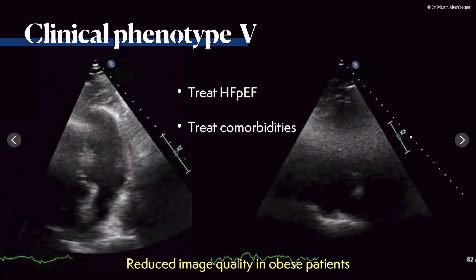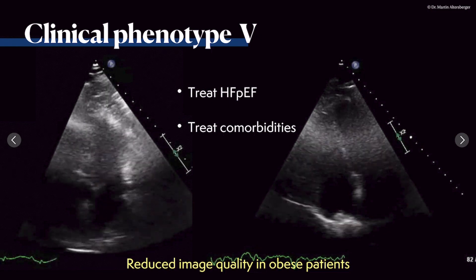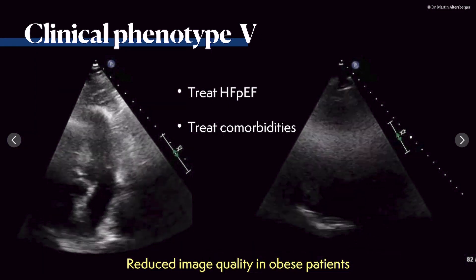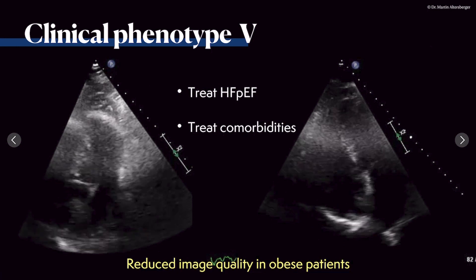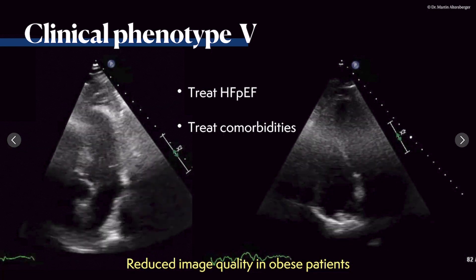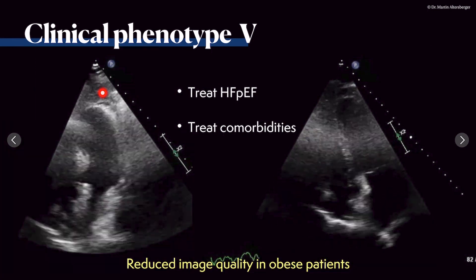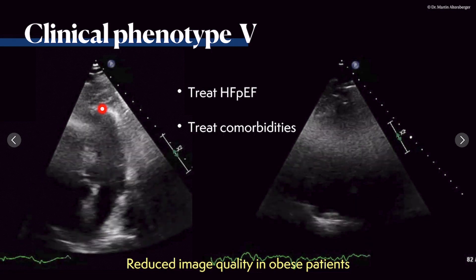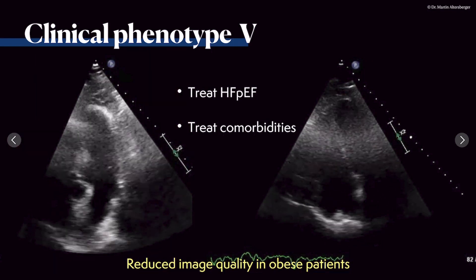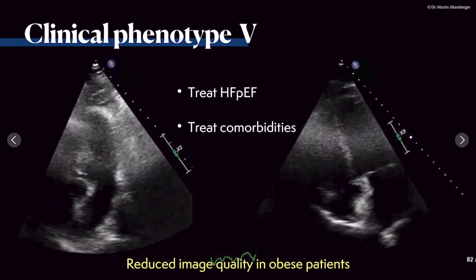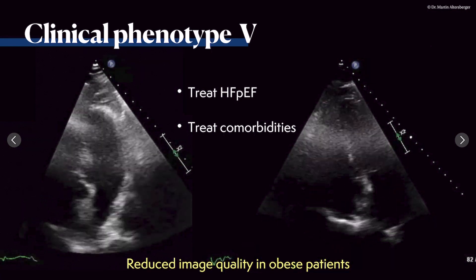What can we do with clinical phenotype 5? Now we can treat heart failure with preserved ejection fraction and also treat the comorbidities. This is an example of an obese patient. We see a lot of fatty tissue, also in the pericardium and around the heart. There is a definite reduction in image quality, which is a huge problem with obese patients.